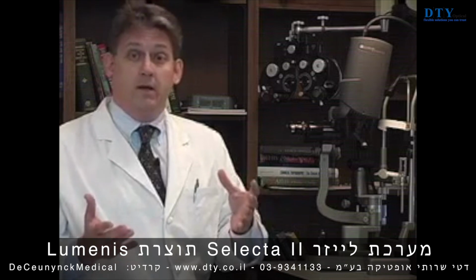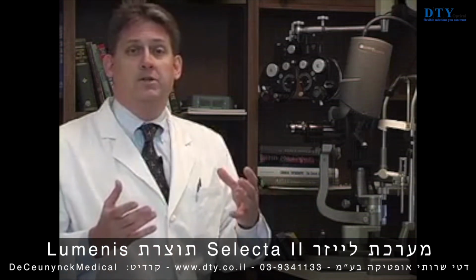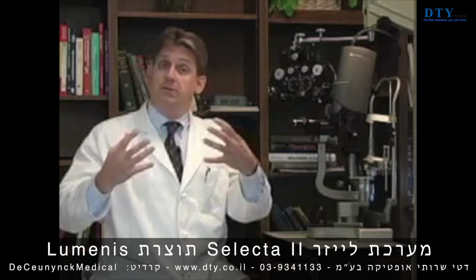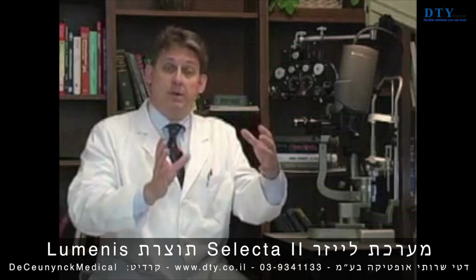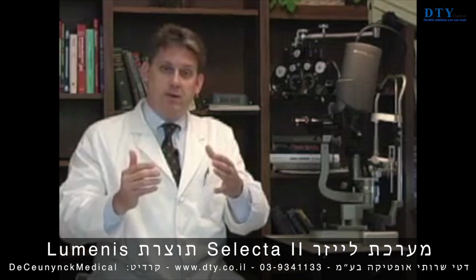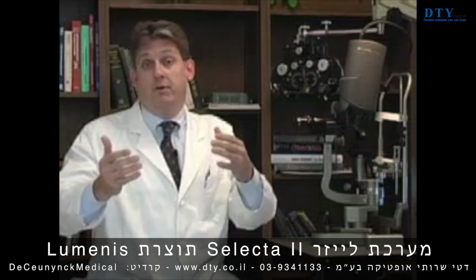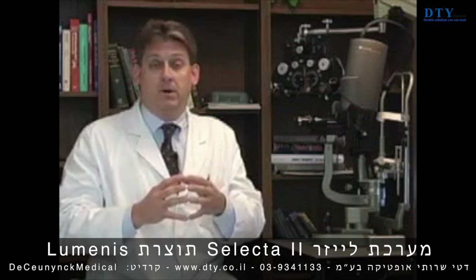Patients like it. ALT was useful, but SLT is different. It uses a lot less energy. Patients have read up on it and like the technology, and it's comfortable. In our practice, a number of patients that are higher risk are referred in. These may be on maximally tolerated medications, and yet surgical knife surgery is not without risk. Even in some of these patients, the appropriate patients, SLT, depending on their profile, may offer an opportunity to at least delay, if not avoid, surgical interventions associated with their complications.